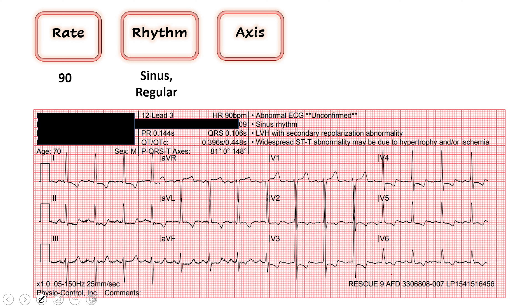Next we determine axis. If you remember how we do this, we look at leads one and AVF. Lead one is your left thumb — the majority of the QRS vector here is up, so we're thumbs up in lead one. And then AVF, I'd call it kind of equivocal. Lead two is the tiebreaker, and that's up. In general, when that happens it probably means your axis doesn't matter, but here we'll call this up because our tiebreaker lead is good. So we'll give this two thumbs up — normal axis.